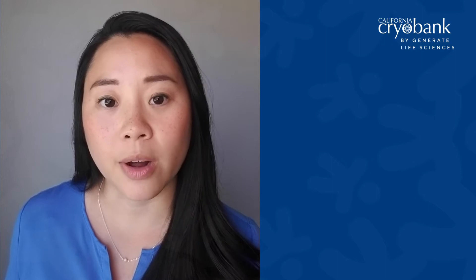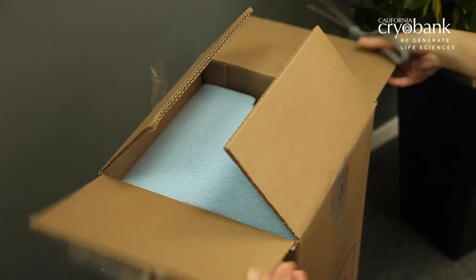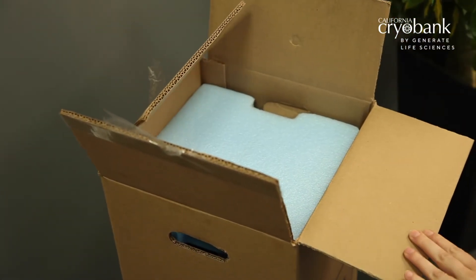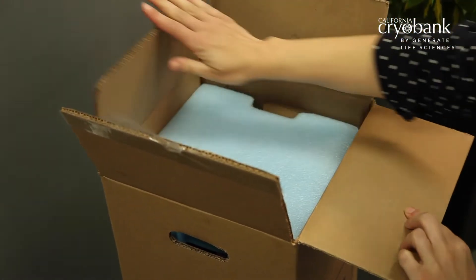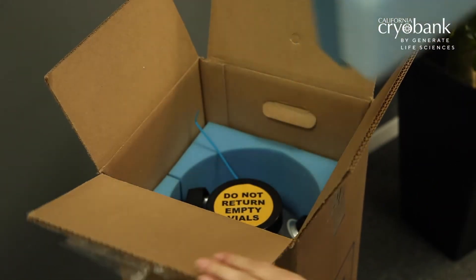When you first receive the tank from us, please check the condition of the tank before starting the insemination process. You can verify the tank condition by following these few easy steps. Open the box and set aside the inner foam inserts — you'll need them later to ship back the tank. Please note that some smaller tanks may not have a foam insert.